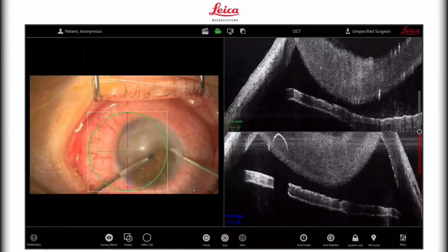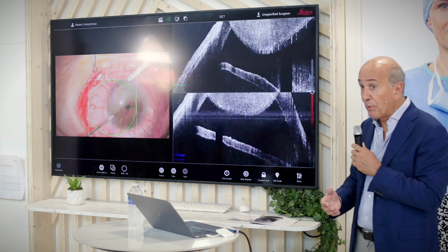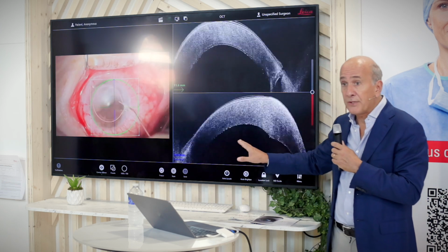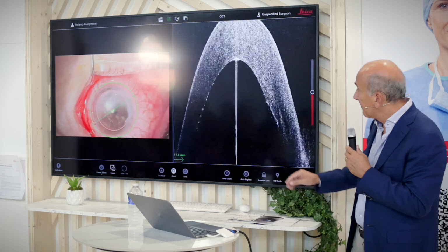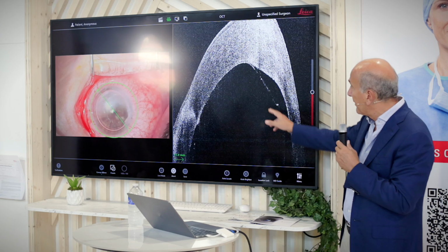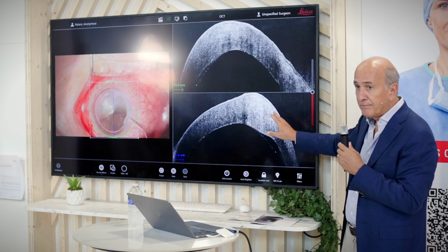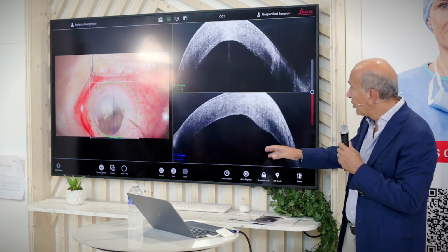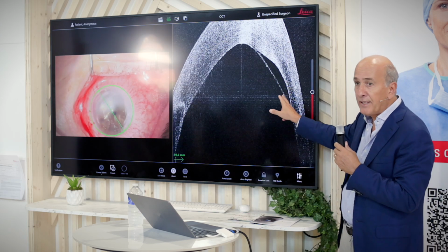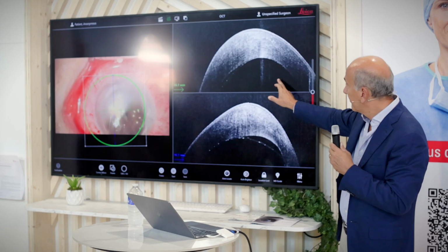First of all, we did an iridotomy inferiorly because we didn't want to cause a pupillary block in this patient. And you can see that even through an opaque cornea, the iridotomy is patent. Then we put an air bubble inside the anterior chamber, but nothing happened. The Descemet membrane remained the same, detached. So I put a larger bubble inside the anterior chamber, and nothing happened again. There was still liquid there, not reabsorbing.